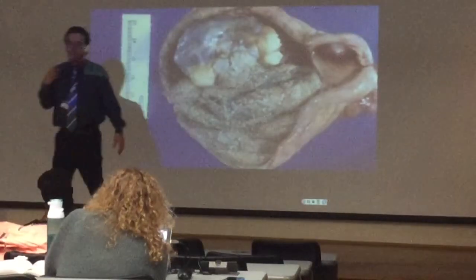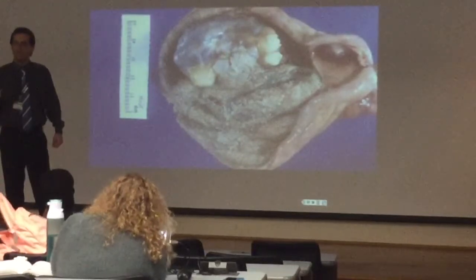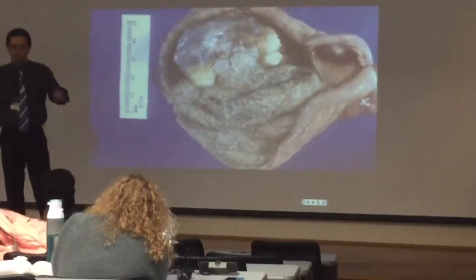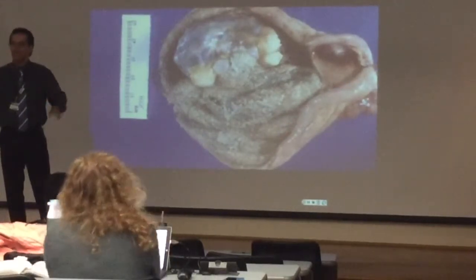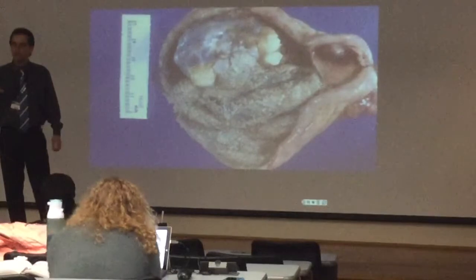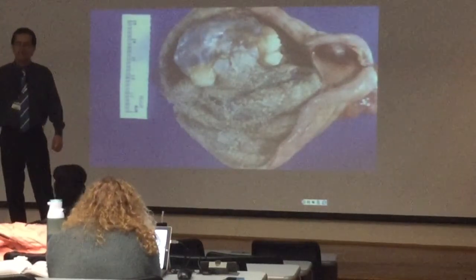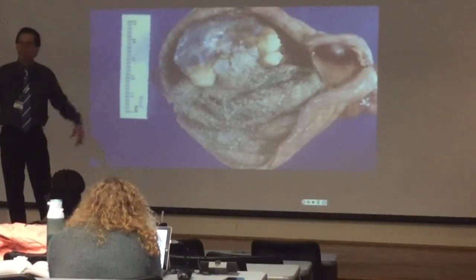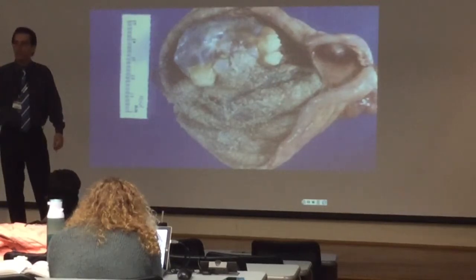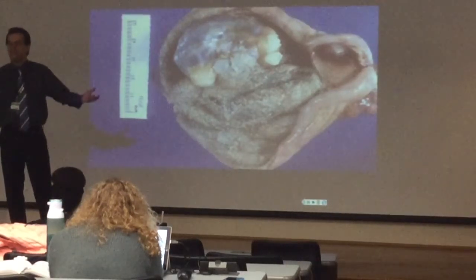Mature cystic teratoma, and I said benign. The differentiation between benign and malignant is the type of epithelium. If they're all mature, all types of epithelium from the 3 germ layers, when I said mature means adult type, means benign. If you see any immature, meaning a kind of primitive type of epithelium or material that normally you don't see in adult type, or they call it embryonal type of epithelium, those are immature, and those are malignant. So making the difference between malignant versus benign, or immature versus mature, is the type of the epithelium, the type of the tissue.